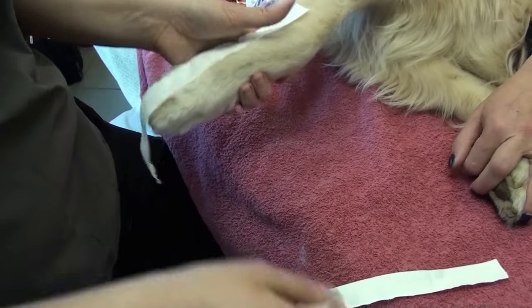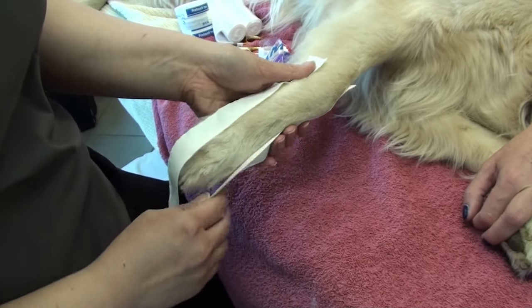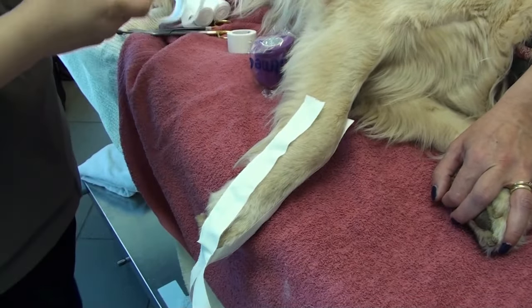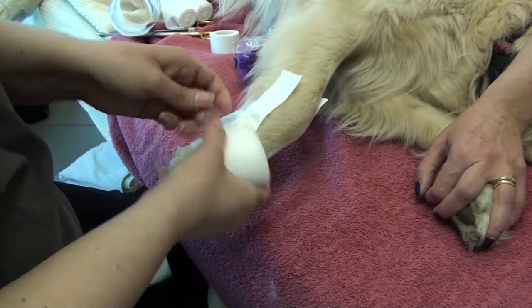Jennifer is going to apply the carpal flexion bandage the way she likes to do it, by first bandaging the limb. With a bigger dog I think that is also a good idea because you're going to have to place more tape on this patient.